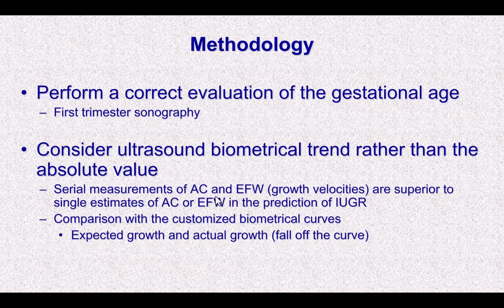As a methodological approach, we have to perform a correct evaluation of the gestational age. Particularly, we have to refer to the first trimester sonography in order to be aware that the gestation is correctly dated. We have to consider the ultrasound biometric trend rather than the absolute value.